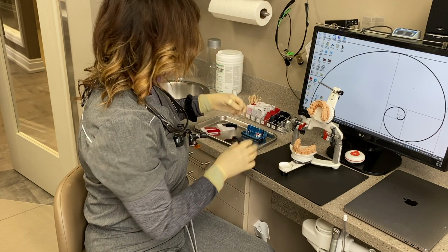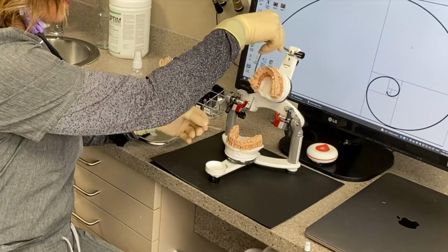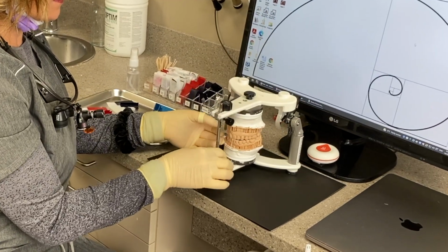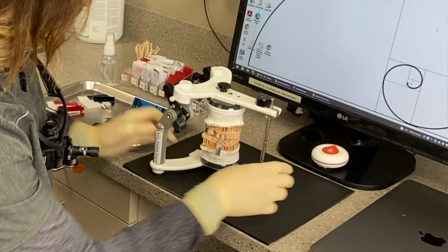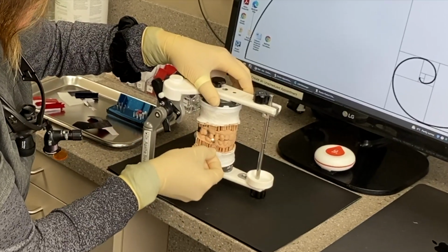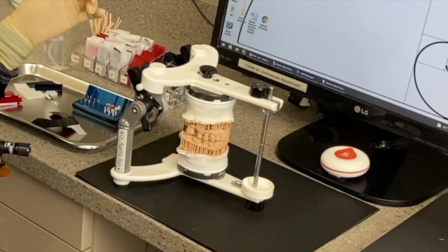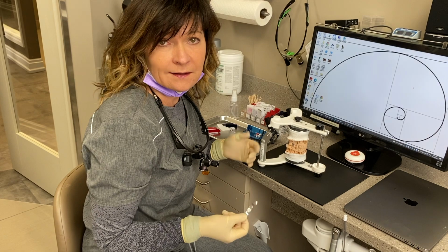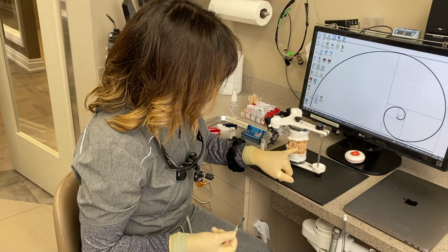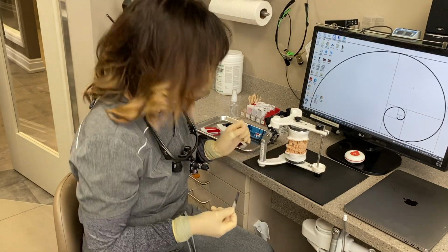So to test it, I'm just going to use a little bit of shim stock, and I can put this in between, and the paper really holds. I'm going to try and pull it, it holds. Whereas anywhere else, if I put it here, it comes right out. So that's a very simple way of knowing that there's a prematurity on this tooth. And oddly enough, this is the tooth with the massive bone loss.